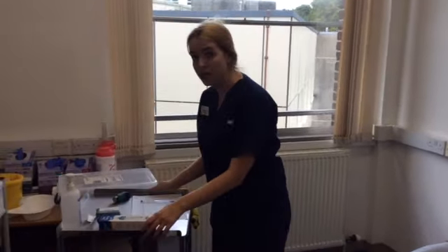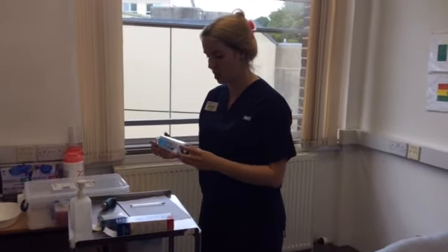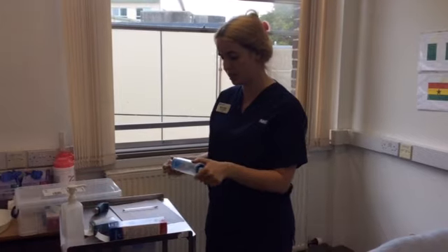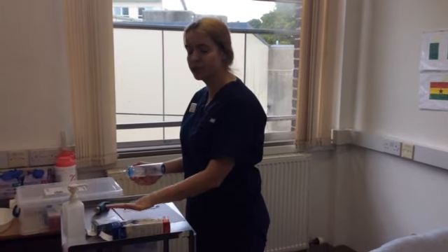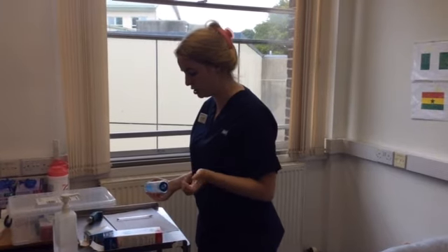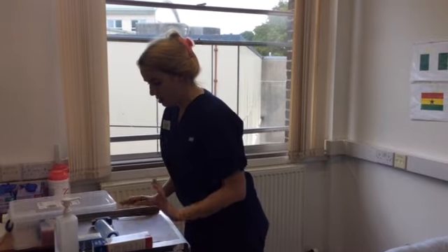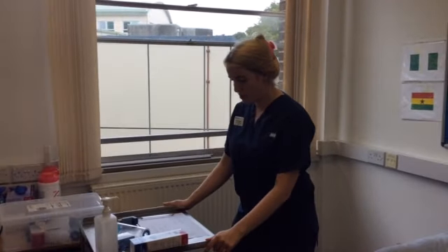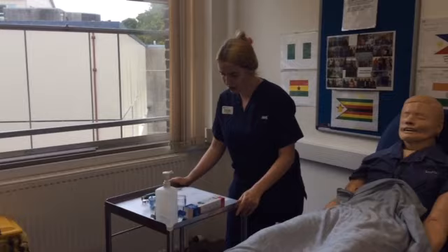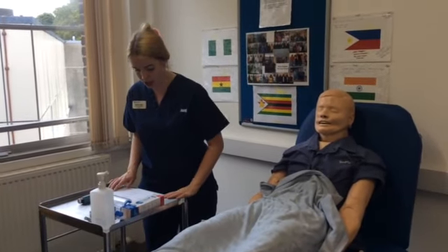The other thing I'll need for this station is this space chamber. So this is my space chamber. I can see it's clean, intact, and it's safe to use. Both of these are single patient use, so I'm happy that they haven't been used by any other patients, so I can go ahead and use them. So now I'm going to go back to my patient's bedside and carry out a second ID check before I explain to him how to take the medication.